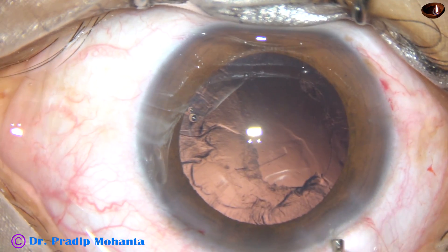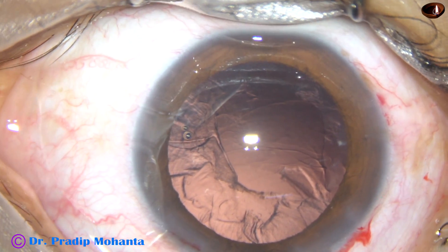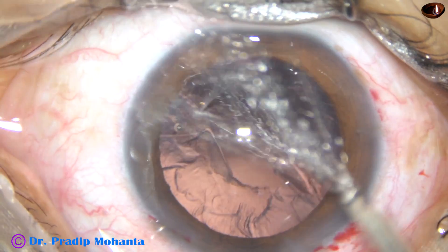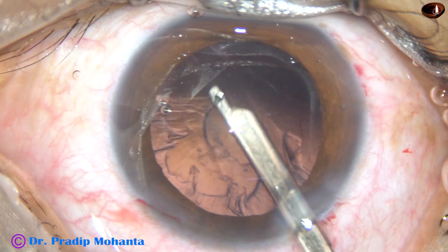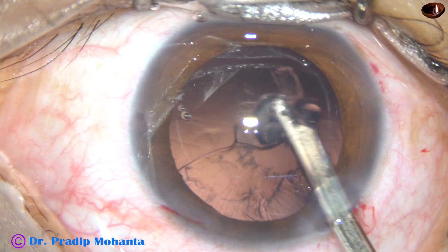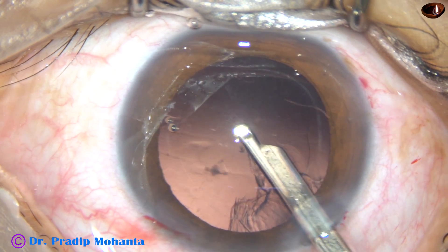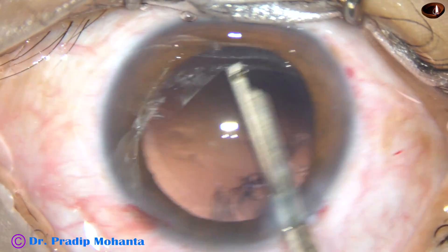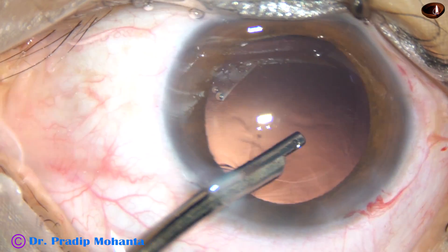Now inject some viscoelastic substance — this is 2% HPMC; use whatever you want. I use most of the time this 23-gauge Simcoe cannula, and see how beautifully you can remove it within a few seconds. With bimanual also you can remove it in a few seconds, but to get the bimanual ready you have to wait about 10 to 12 seconds. By this time half of the lens matter is removed, and this is the sub-incisional cortex — it has come out.